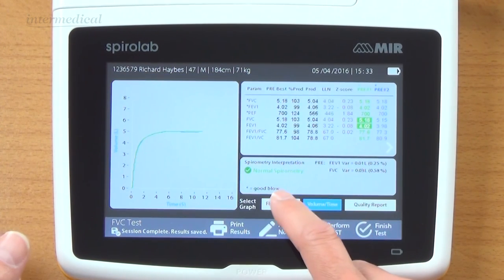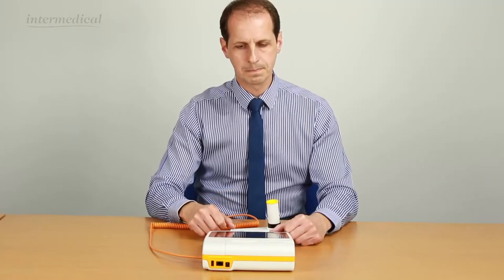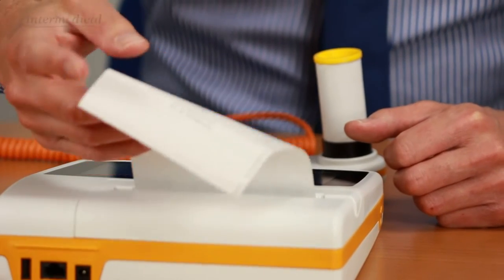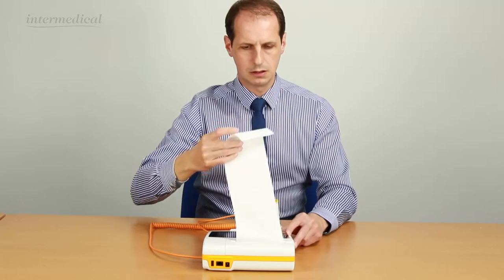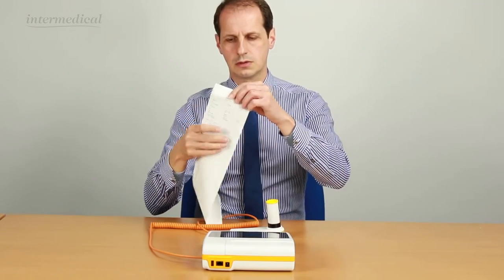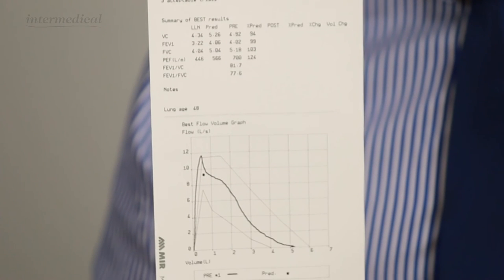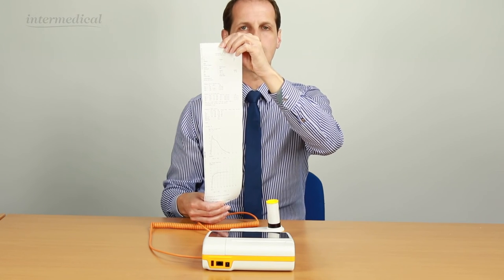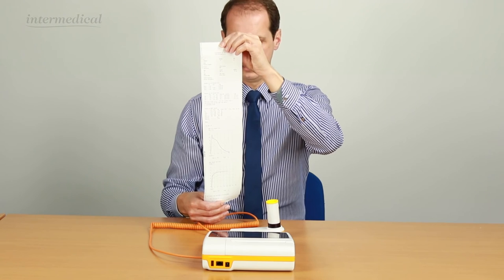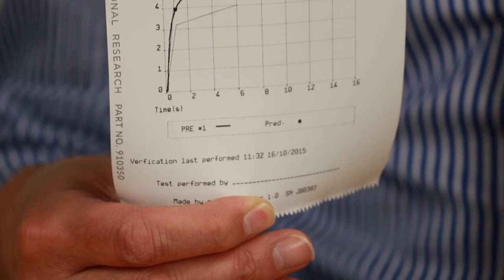We can look at the quality report, which says it was a good session, and look at the volume time graph too. Down here we get the option to print the results, add notes, perform a post-test, or finish the test. I'm going to print the results. The printer is really quick and prints both graphs in very high definition. The printout shows patient details, tests performed, results for the best tests compared to predicted, graphs with the predicted area, and at the bottom it tells you when the spirometer was last verified using a 3.0L calibration syringe.